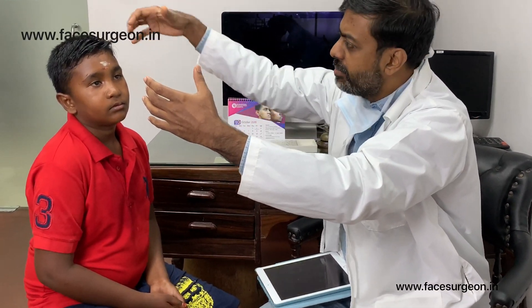The biggest advantage is that younger patients can be treated — you don't have to wait until they're 16, 17, or 18, and you don't have to wait for the condition to worsen. The next big advantage is that the conventional appliance, known as a halo frame, was very cumbersome — difficult to wear to school, difficult to sleep with. Now there are no such issues: you can sleep normally, go to school, work, and also eat normal food.